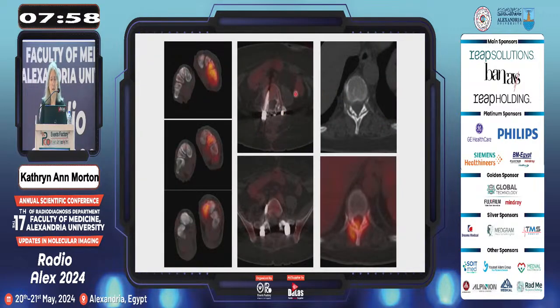This is another patient with bacteremia. They had also had spinal hardware, which actually looked pretty good. There was a mid-foot osteomyelitis, and there was this unsuspected uptake in the lower thoracic spine, sort of centered at the facet joints, with a mass that appeared to extend into the epidural space. When you see this, you've got to have an MRI, and it confirmed that there was an epidural abscess in this patient.